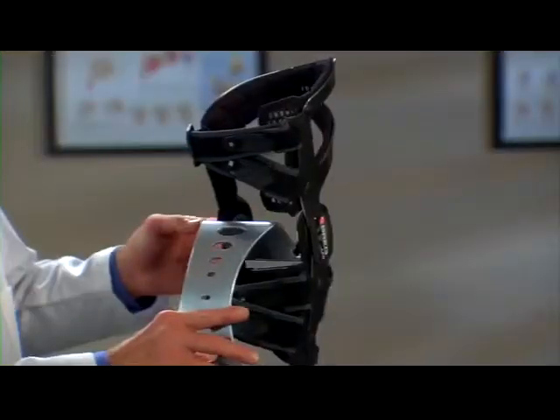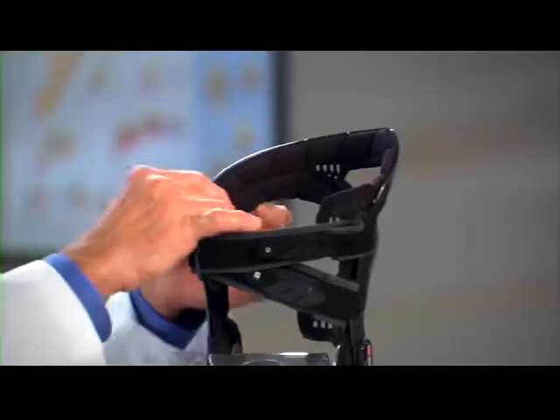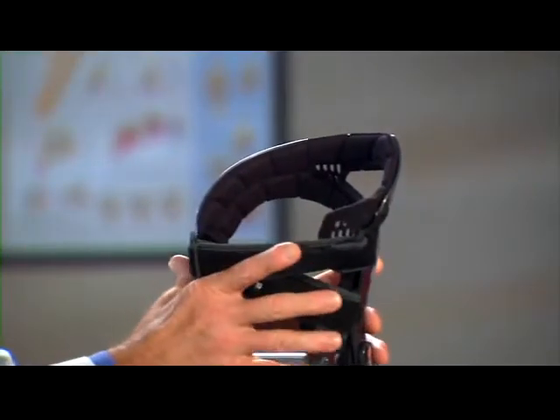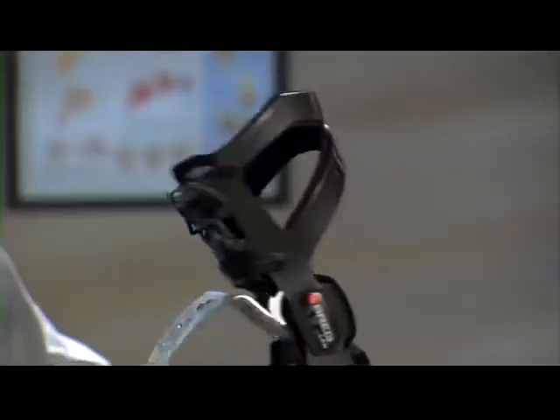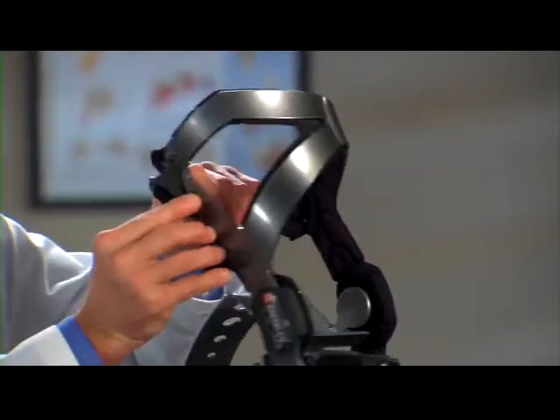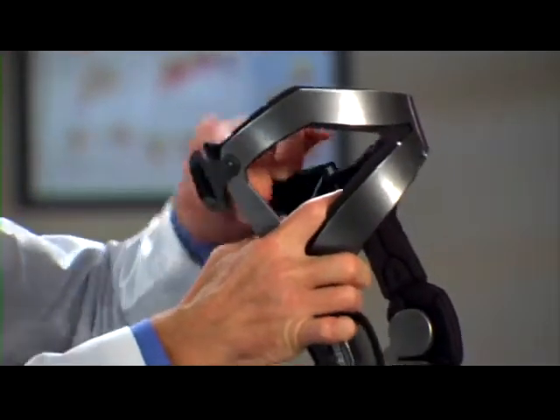Third, LPR has grooves and ventilation windows cut into the padding. They're designed to move moisture and heat away from your skin, helping you stay cool and comfortable. This padding also grips your leg to help prevent the brace from moving around on your knee. See these strap tabs? They pivot so the straps can accommodate the unique anatomy of your leg.